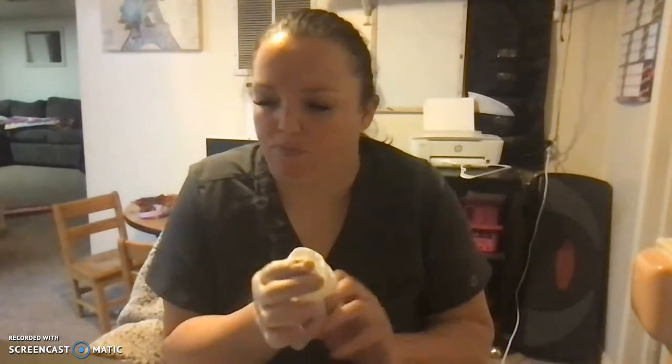And then I would remove my gloves, put this in the sharps container. Well, I would have done that before I took my gloves off. But I would have discarded my needle, took off my gloves, performed hand hygiene, cleaned up my mess, and then document the procedure. Thank you.